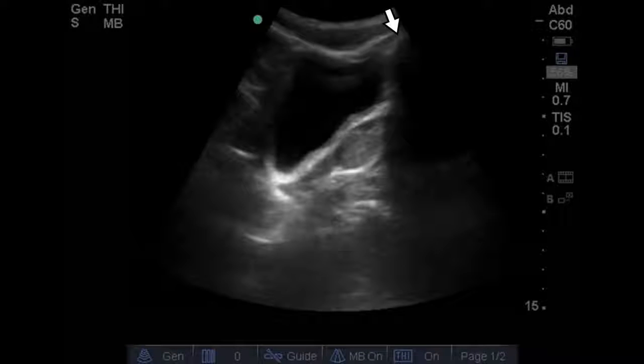Once again, we're looking for the pubic symphysis, bright hyperechoic line showing the bony structure with posterior acoustic shadowing. Now, when we're looking at the area around the bladder, in this male patient, we can see the prostate. This area of the bladder wall and the area posterior to it shows the prostate in the pelvic floor. Remember, this is not the intraperitoneal area. This area is the intraperitoneal area where we're looking for free fluid.